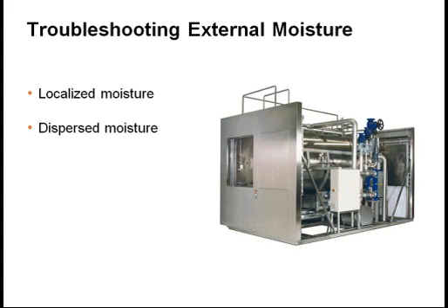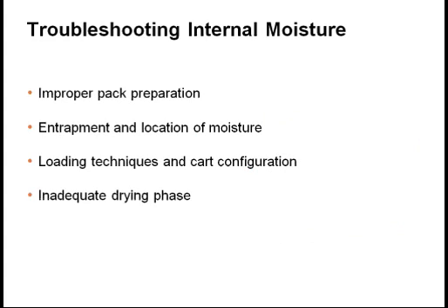Follow AAMI recommended practices and the sterilizer manufacturer's recommendations regarding the weight of packs. Limit set size and density to allow ample room for sterilant penetration to the items during sterilization and for the removal of moisture during drying. Remember to properly load the sterilizer.